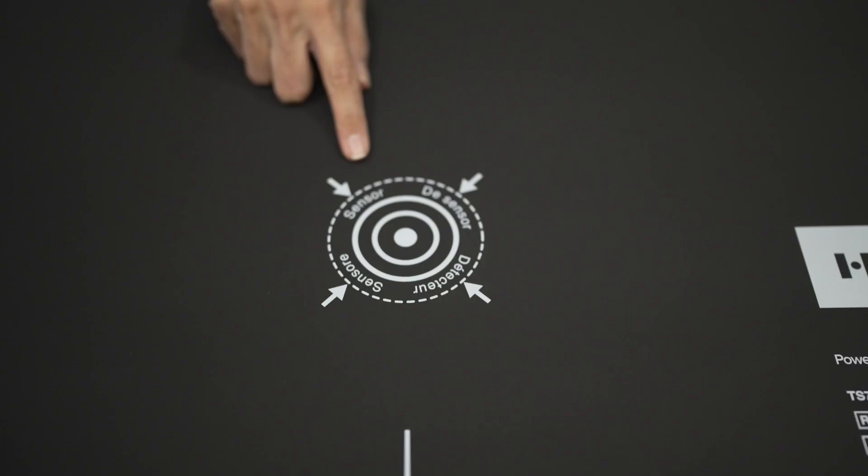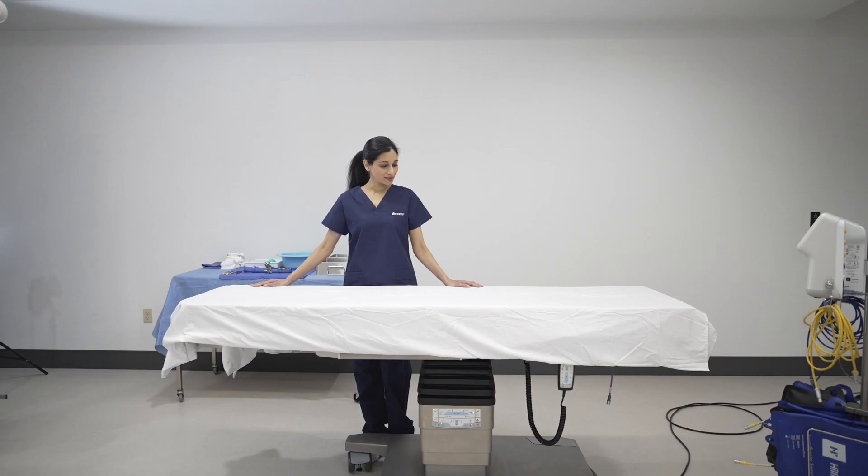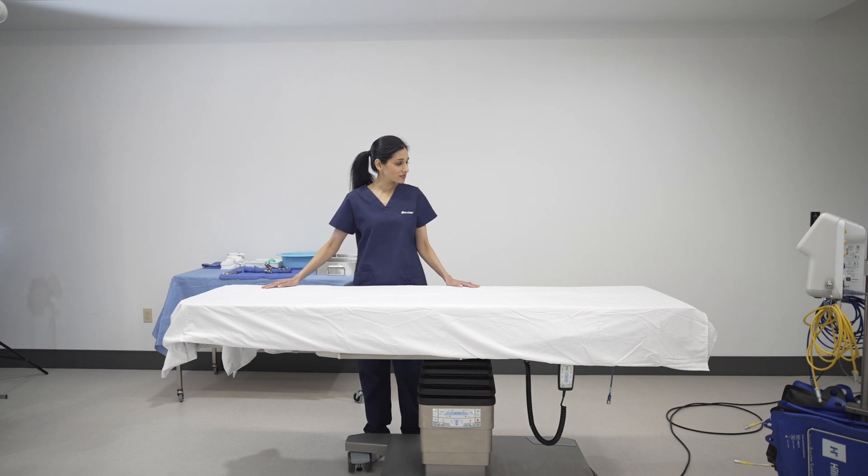Both the pads and blankets have a primary temperature sensor indicated on the surface. This sensor provides a feedback loop to the controller on the temperature of the warming surface. Only a thin sheet should be used between the pad or blanket and the patient for best warming results. Gel pad placement between warming pads and the patient is not recommended.